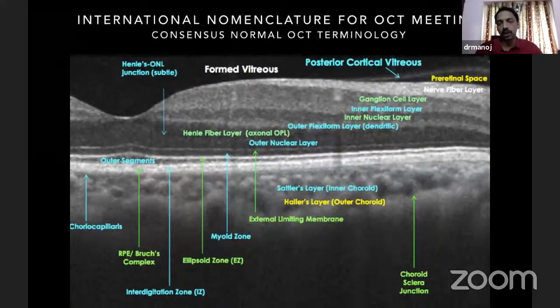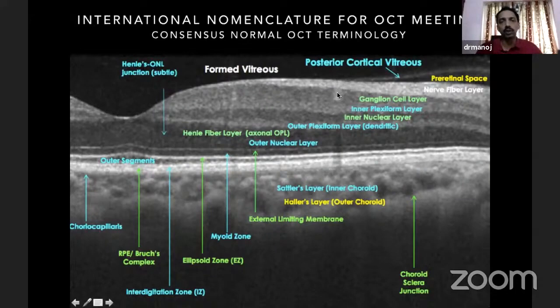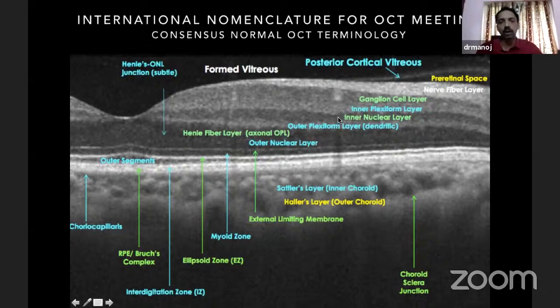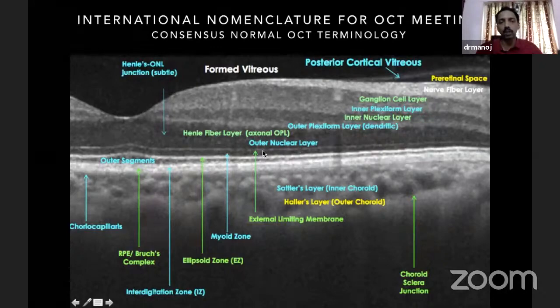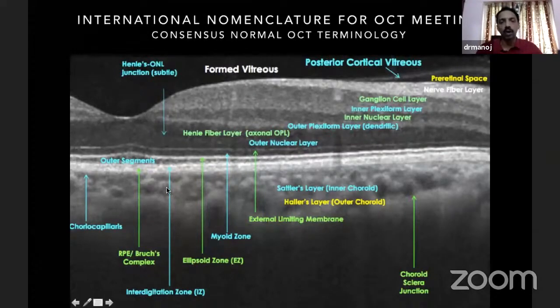This is the international nomenclature. When you see the OCT, these are the different layers — very similar to what you see on histology. You see the nerve fiber layer, the ganglion cell layer, the inner plexiform layer, the inner nuclear layer, the outer plexiform layer, and the outer nuclear layer. The outer nuclear and inner nuclear layers are less reflective; the plexiform layers are more reflective. The outer retina consists of the external limiting membrane, then the ellipsoid zone (formerly called the ISOS layer), then the interdigitation zone.